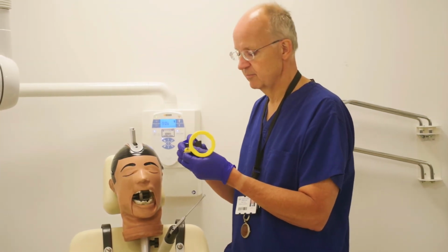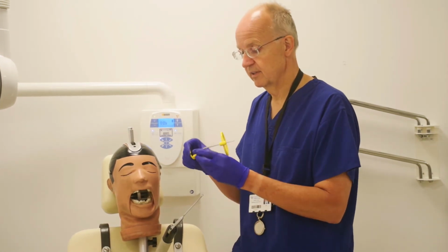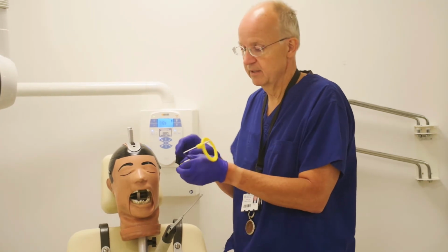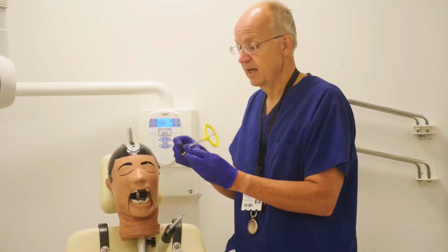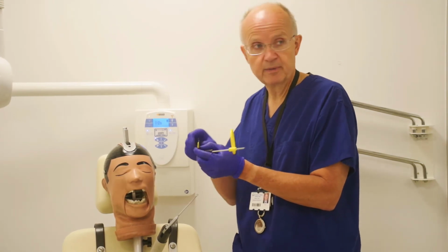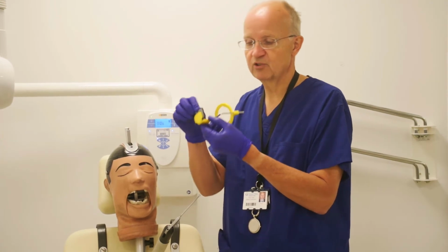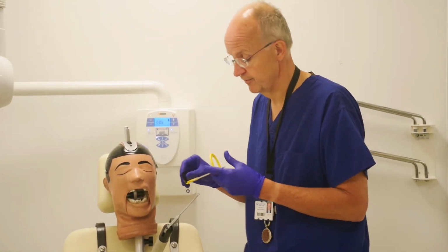So it's a good idea sometimes, if you can, just to put something else in there with them. I quite like using the little bite tabs, which you can get, little bits of cardboard that are specifically made for bite wings actually, but I pop them in there to hold them nice and tight. I know Sarah uses a little bit of sterile paper from the packet. People use a variety of things, but the main thing is to make sure it doesn't move around. Otherwise, sometimes you can see it drops off.